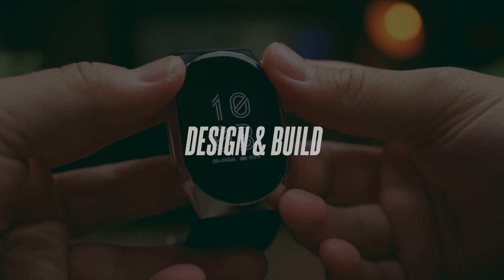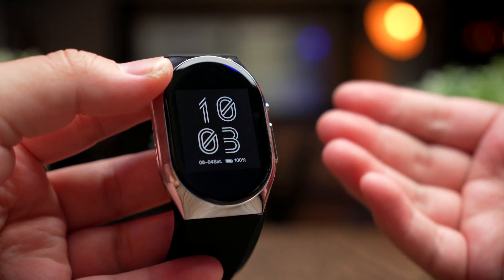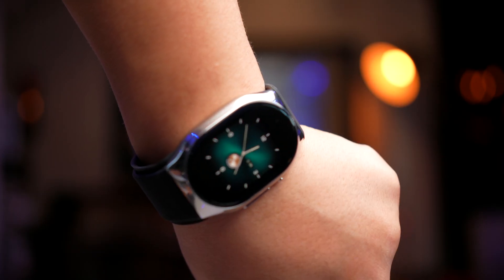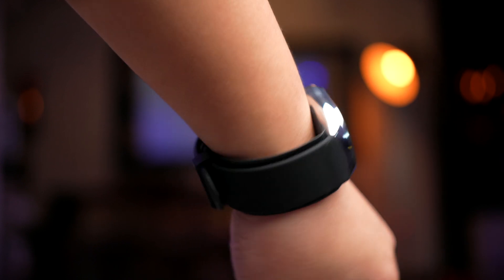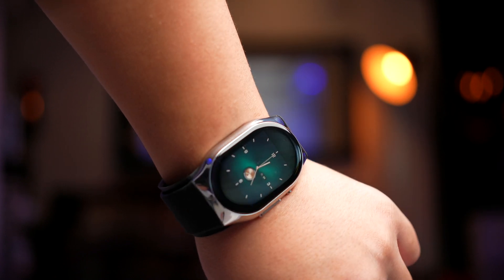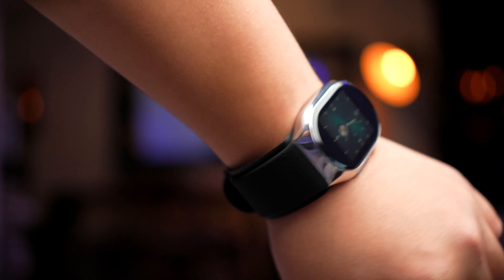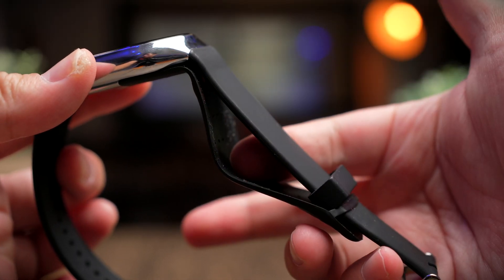This is not your typical smartwatch, and those who buy it definitely have specific needs and priorities. The watch is built fairly large — even for my large hands it's a little bigger — but this is important since it needs to fit a solenoid valve to pump up the inflatable cuff. Yes, this watch actually has an inflatable cuff, just like a standard blood pressure monitoring machine.